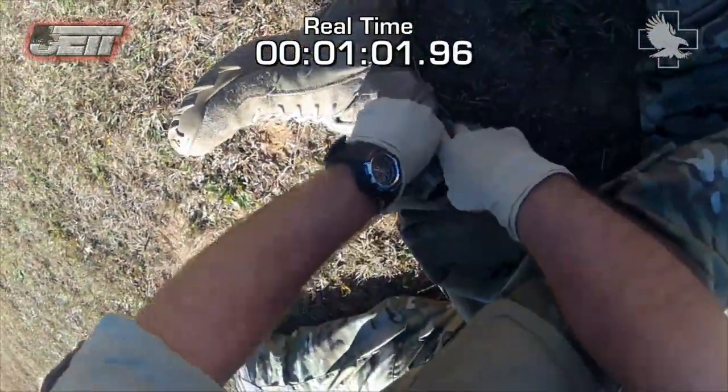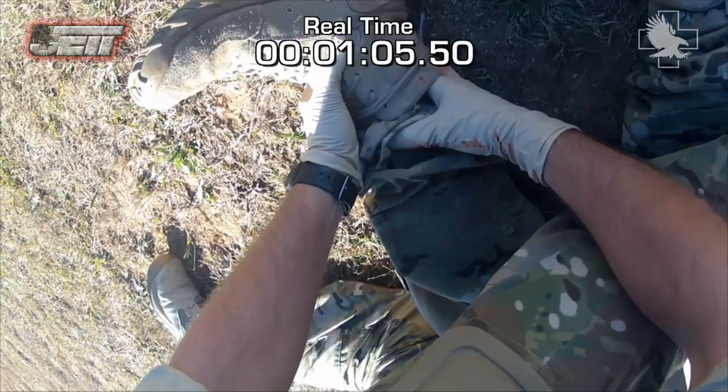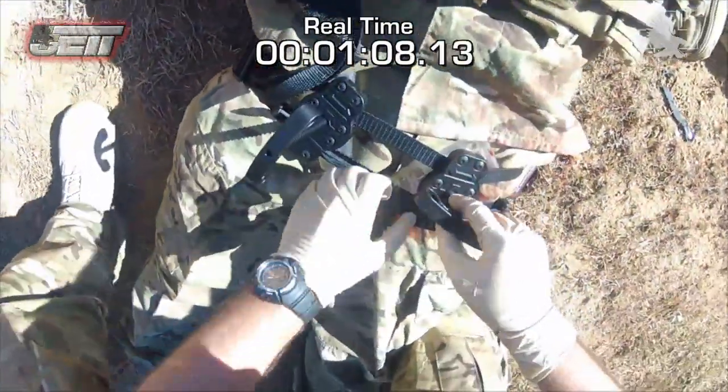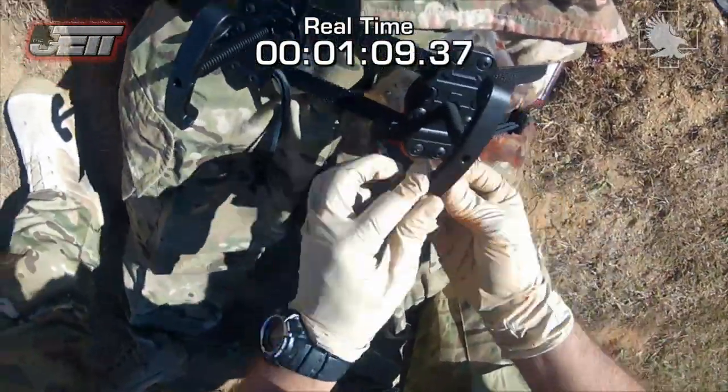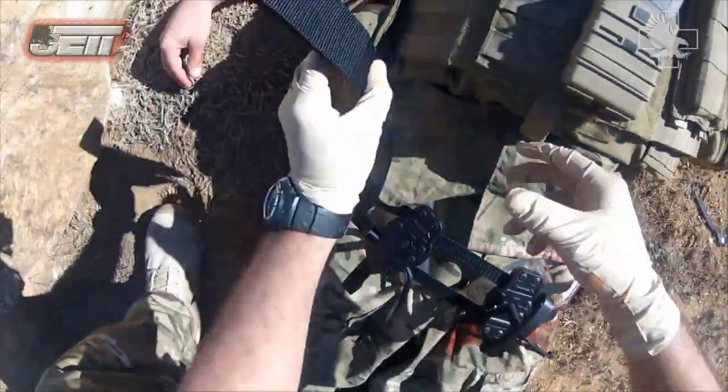High extremity wounds in the thigh-groin region where tourniquets cannot be placed or are less effective require equipment such as the JET to stop bleeding and potentially save the life of a casualty that would otherwise bleed out in minutes. Penetrating trauma, blast injuries, and amputation are examples of injuries that may require treatment with this device.